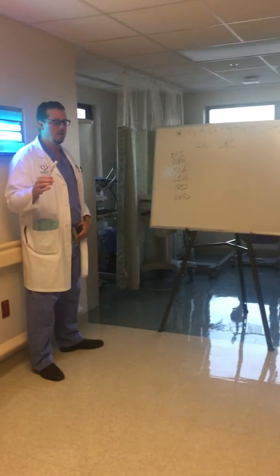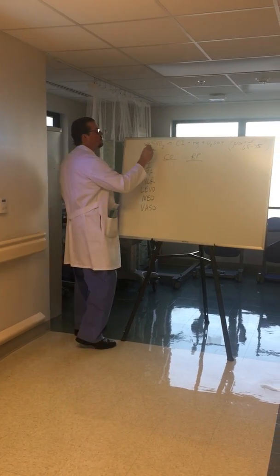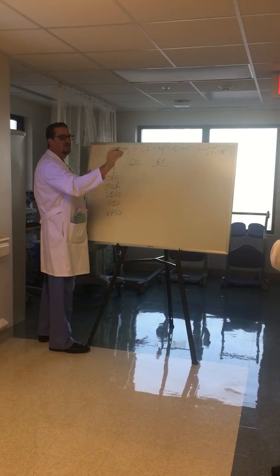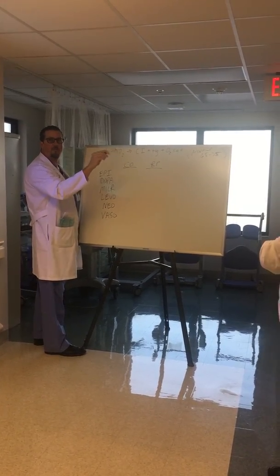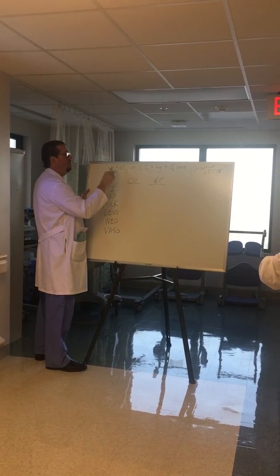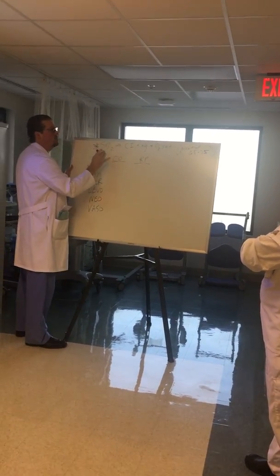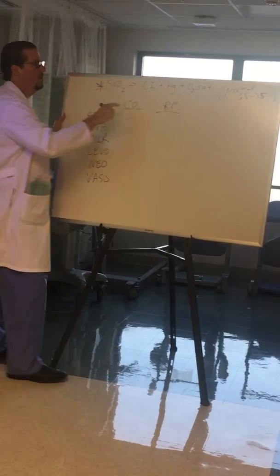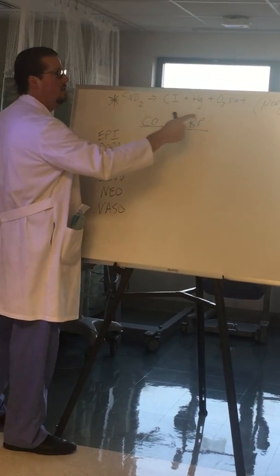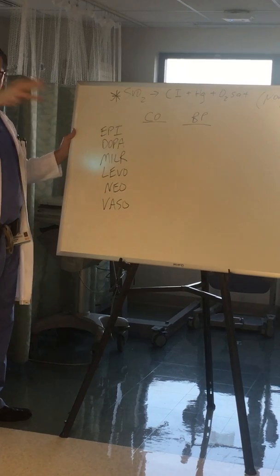But there's something wrong. So to make all this work, this tells you, this will be the first thing that will drop. That's why we have the continuous cardiac output Swans. That's why it's important. This will be the first number that drops. And if this is not normal, and normal is 65 to 75, if this drops, it's one of 3 things: cardiac index, hemoglobin, sat.